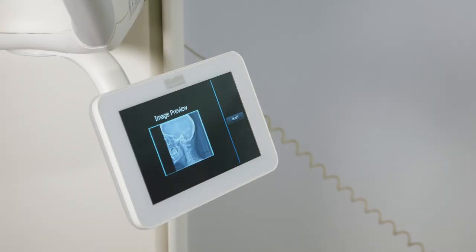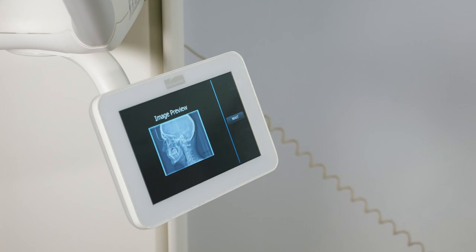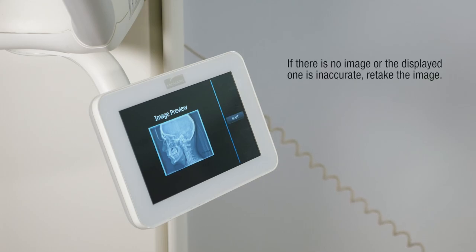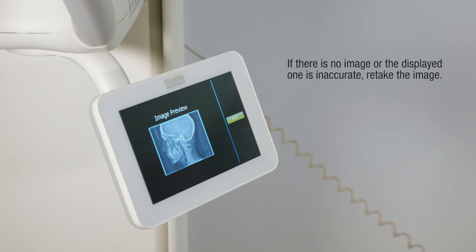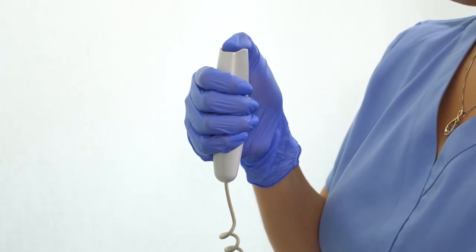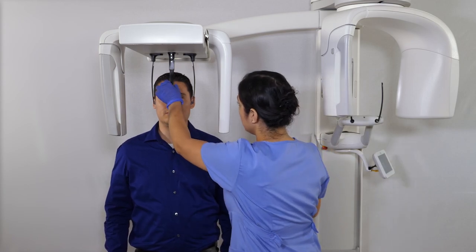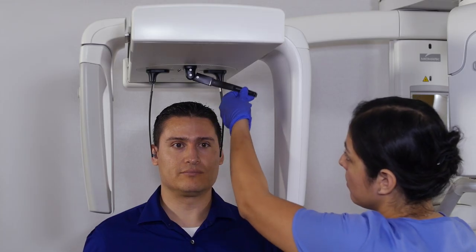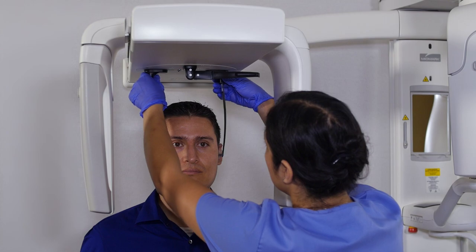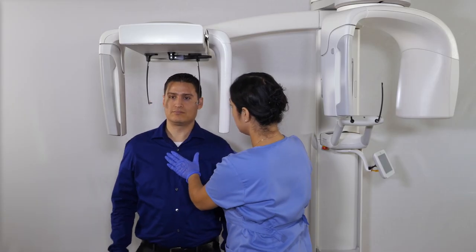If the image preview appears, verify the accuracy of the image. If there is no image or the displayed one is inaccurate, retake the image. Release the patient from the cephalometric by rotating the nasion up and pushing out the otic wands. Help the patient exit the Vantage system.